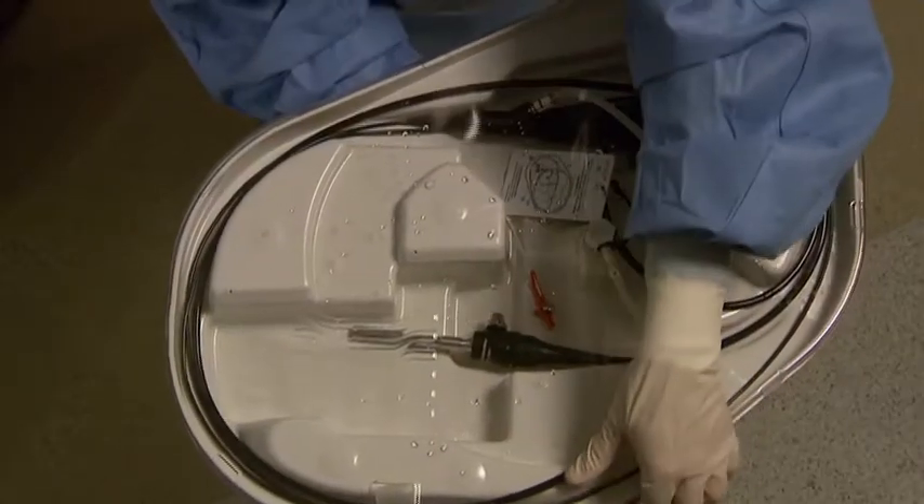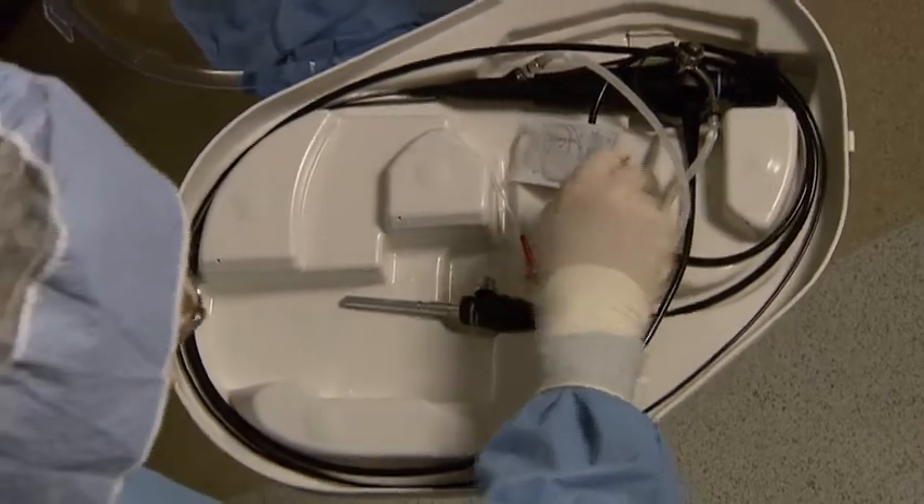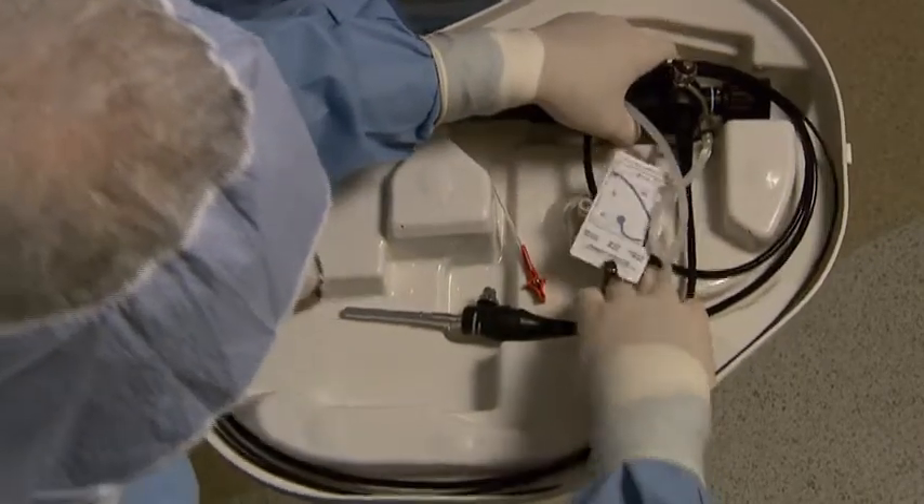The System 1E is validated to reprocess an extensive list of heat-sensitive, immersible, critical and semi-critical medical devices, including flexible multi-channel endoscopes.